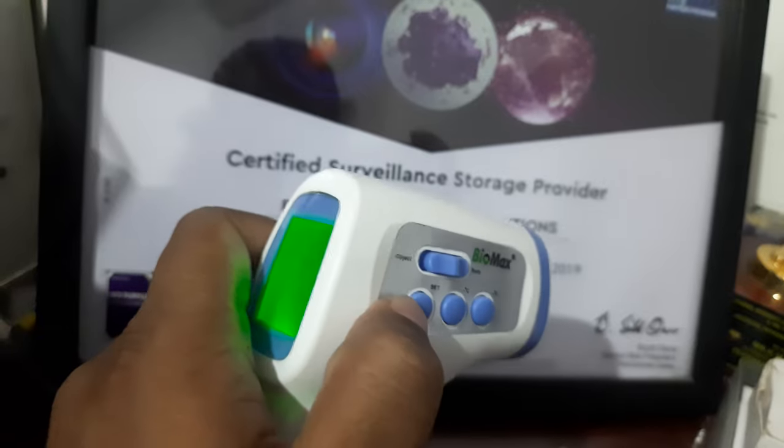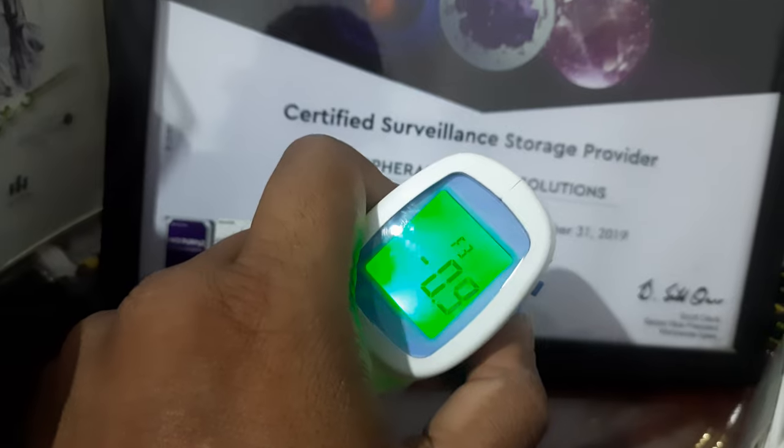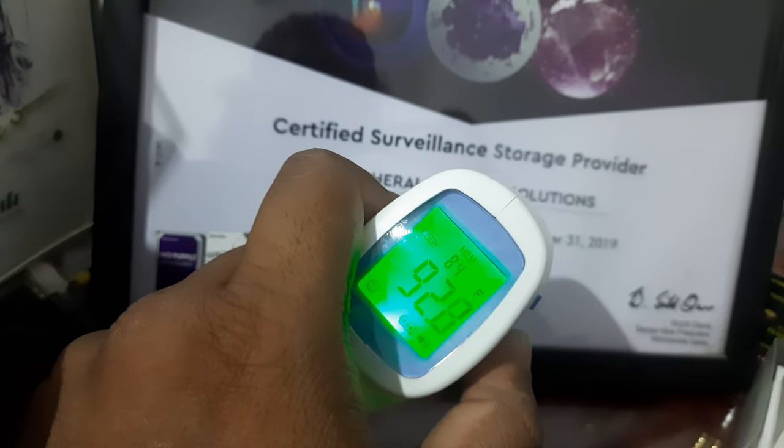Now I need to press this button four times — one, two, three, four. That's it.